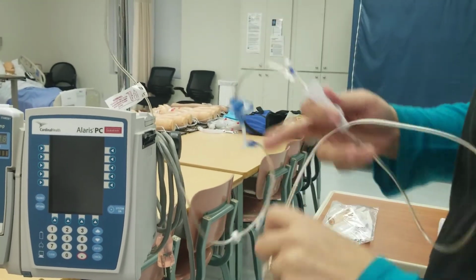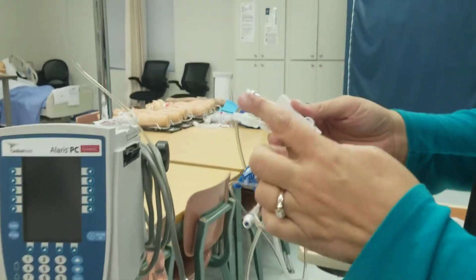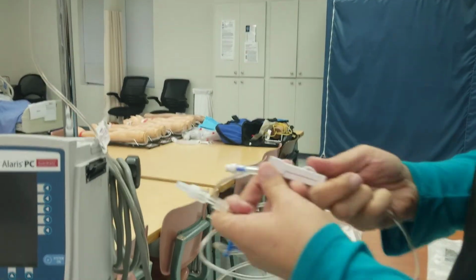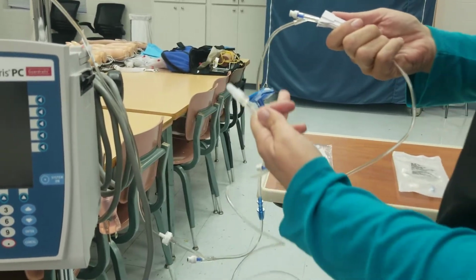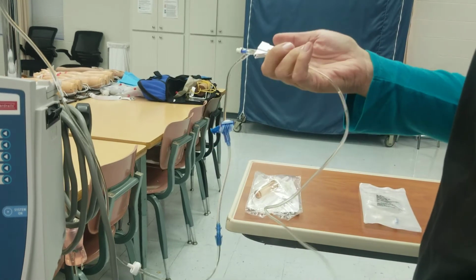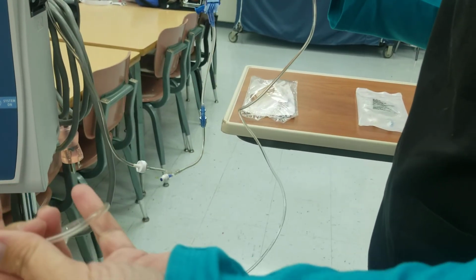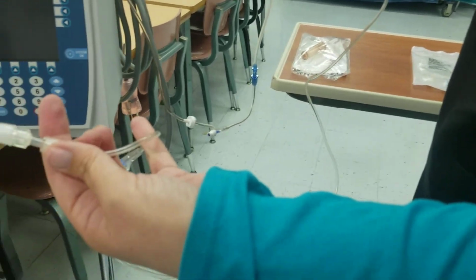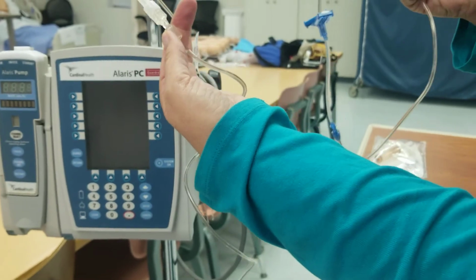So we'll take our clamp, and then we take the end of the line, and it has a cap on the end of it. And we're going to open up the clamp. You see how the fluid's running through? So we're going to watch it all the way down. And so this is priming our line. And you stop when it gets to the end.